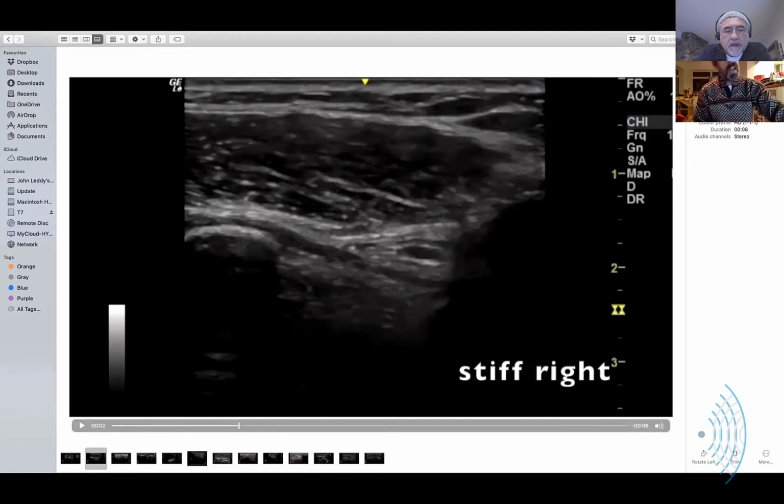Yeah. And if you have a suitable patient, and once you've seen it, you get an eye for the angle, and you'll see that there's another bundle of fibers coming off here, and you have to do it quite slowly. It can be very, very faint, and you have to optimize the picture. But you'll see this band that is not the coracoacromial ligament, which goes that way and is easy to scan, but this one that pitches down. I want to do that, and I'm going to send a good one to you so that you go, good job, Greg.